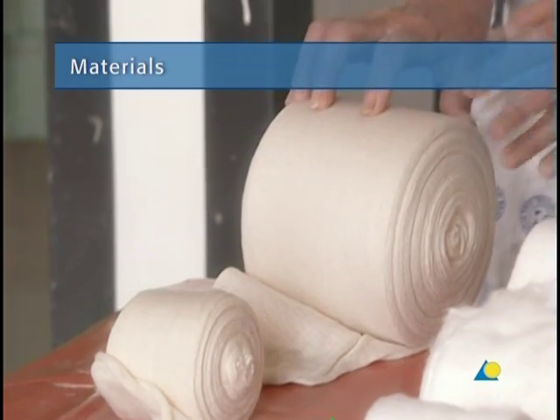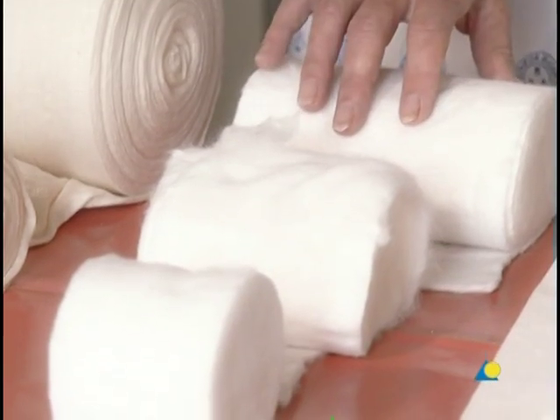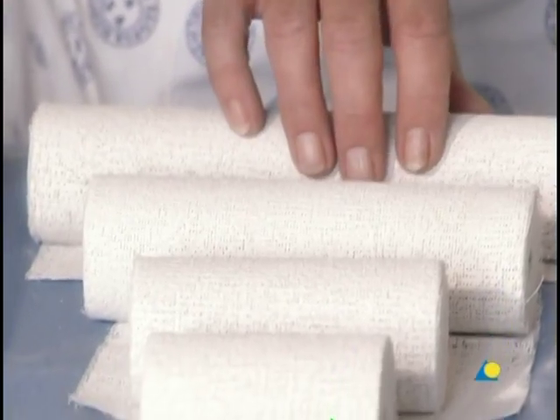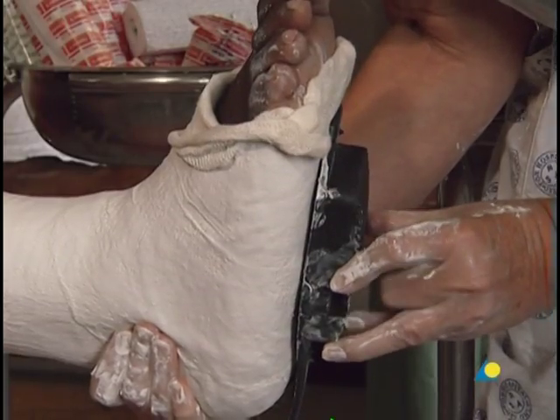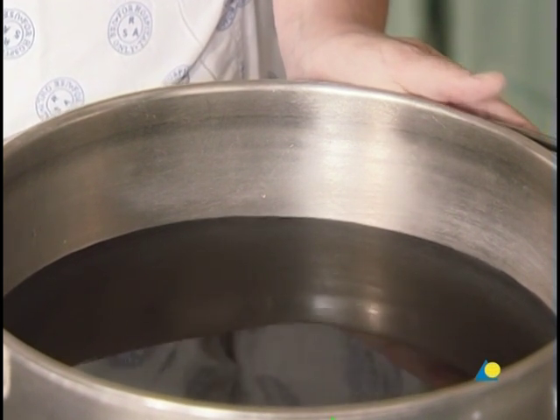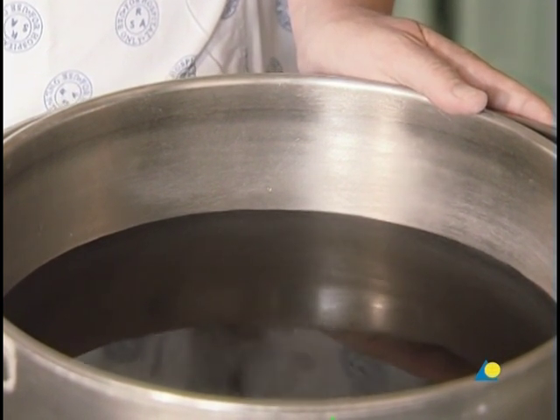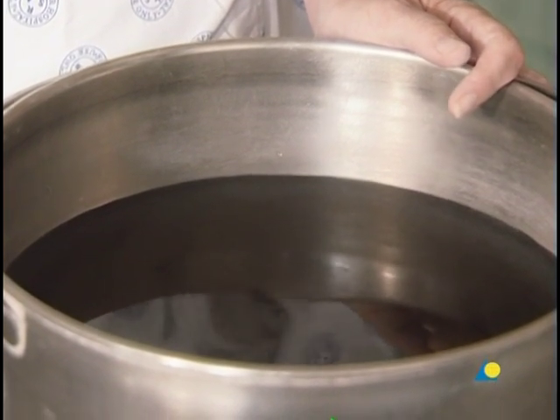To apply a PTB, the following materials are needed: a stockinette or tubular gauze bandage; cotton wool for undercast padding; scissors; plaster of Paris bandages in rolls of varying widths; plaster slabs, generally five layers thick and available in differing widths; a walking rubber; and water or another wetting agent. The water should be tepid or lukewarm, with an ideal temperature of between 22 and 25 degrees Celsius. Colder water or a wetter bandage will allow for increased working time, while warmer water or a drier bandage reduces the working time.